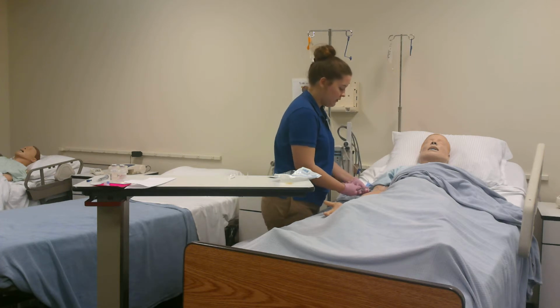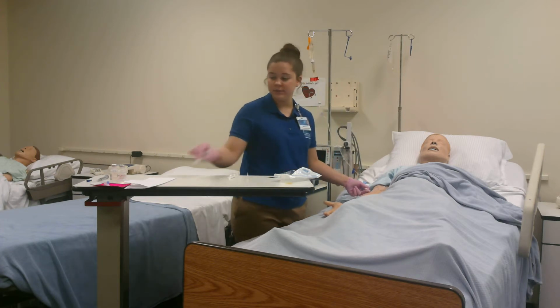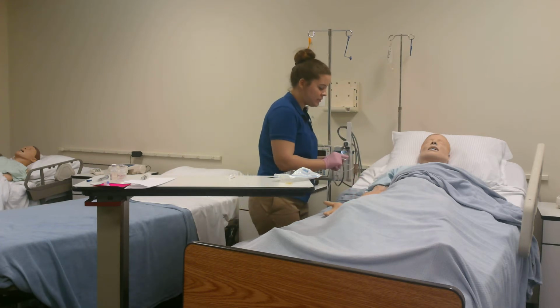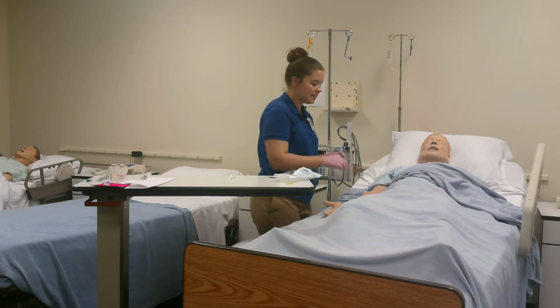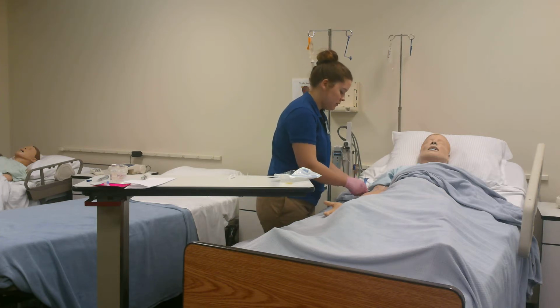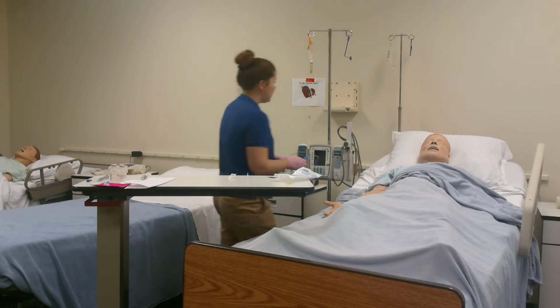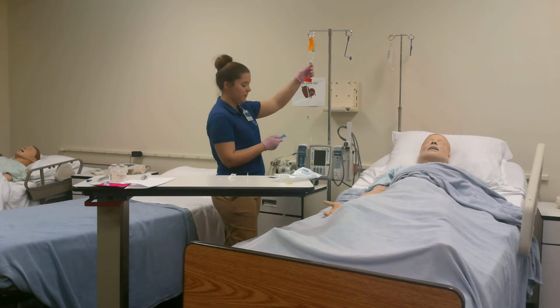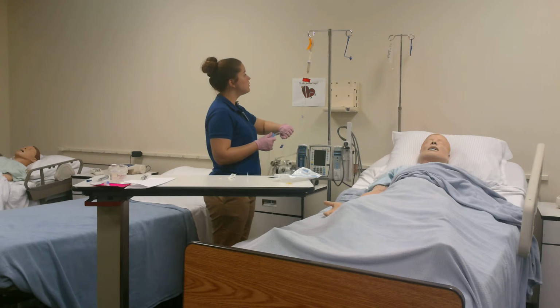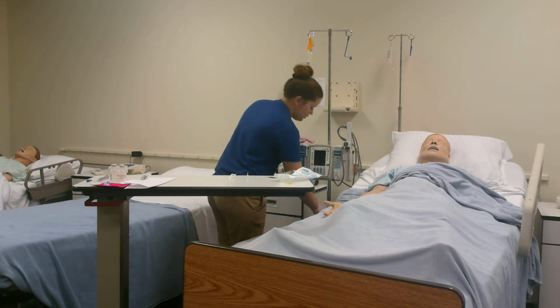Okay, very good, Mr. Jackson. I'm going to dispose of this properly. I'm going to, again, prime my tubing, perform aseptic technique with an alcohol swab, and I'm going to connect Mr. Jackson to his medication. I'm going to unclamp this. This is already halfway filled, so I'm going to establish my flow rate, and we're looking for 8 drops per minute. Okay, very good, Mr. Jackson.